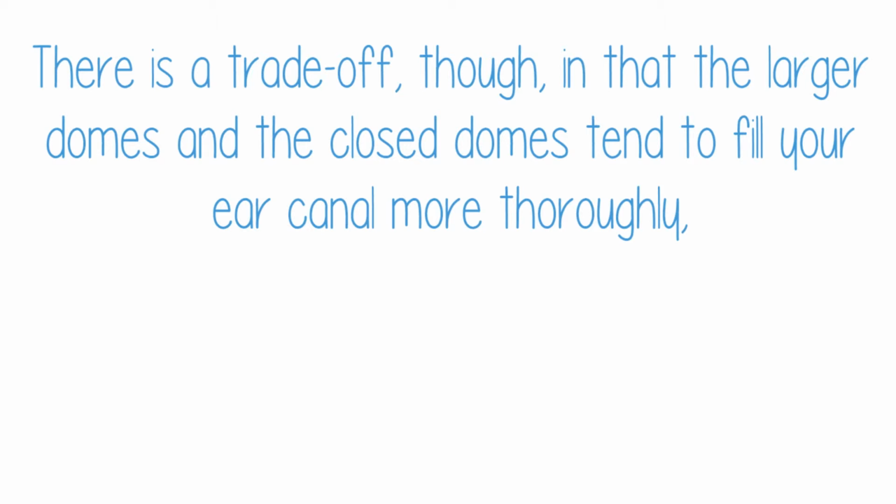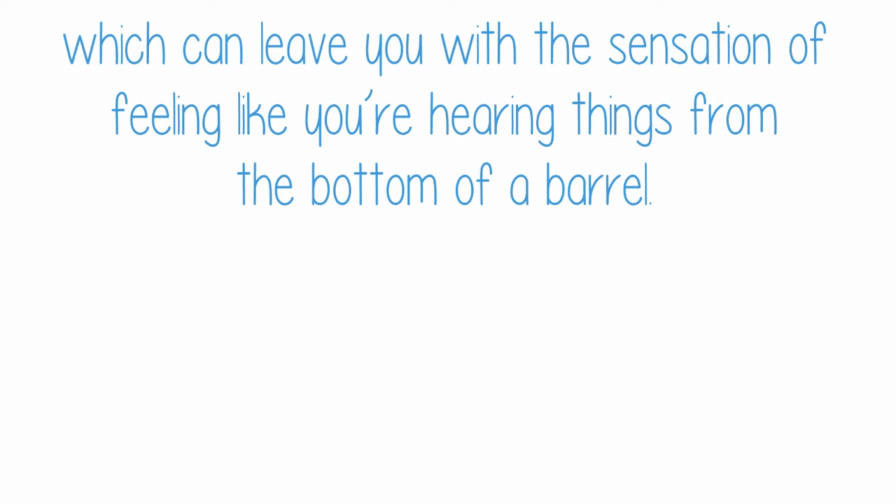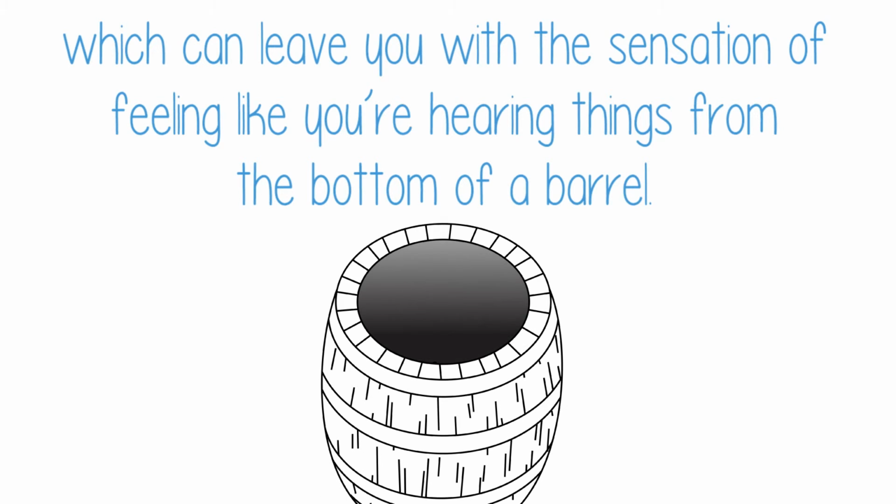There is a trade-off, though, in that the larger domes and the closed domes tend to fill your ear canal more thoroughly, which can leave you with the sensation of feeling like you're hearing things from the bottom of a barrel.